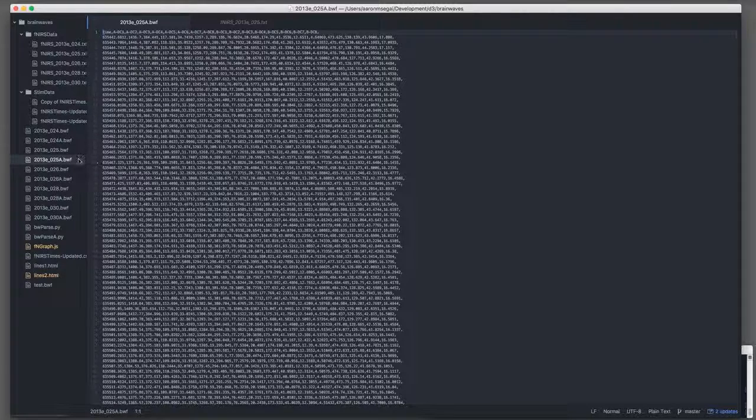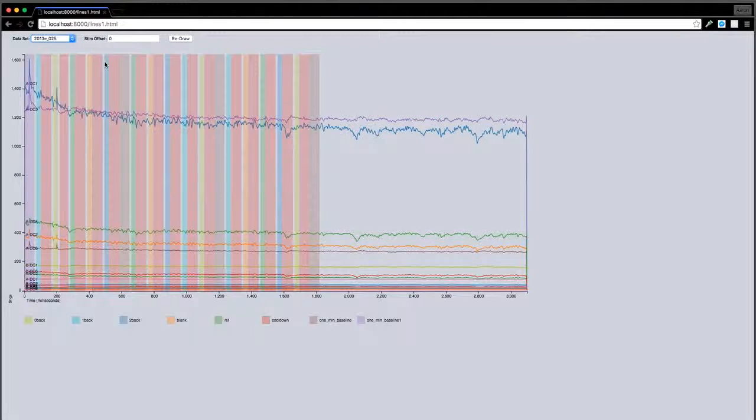So my interface works on these different averaged data files. So here it is. So basically what you can do up here is select which data set you'd like to look at. So I'll go ahead and select the same data set that we were looking at the actual files of. Click that, and it'll take 1 second to load. And so here's the graph that it produces from that data set.